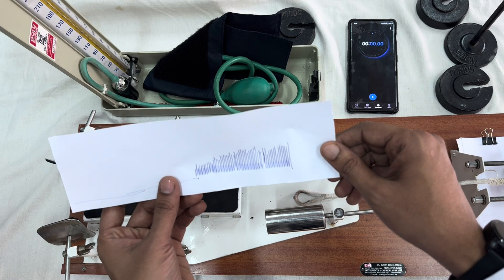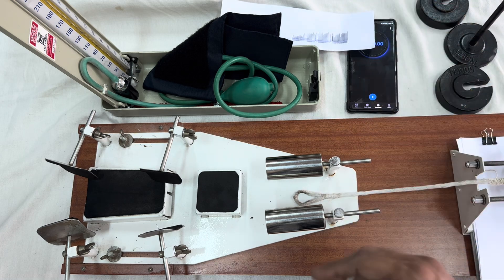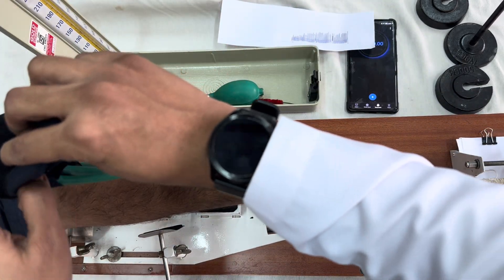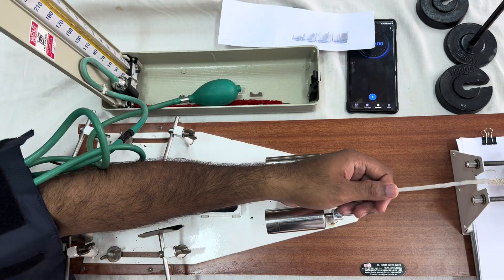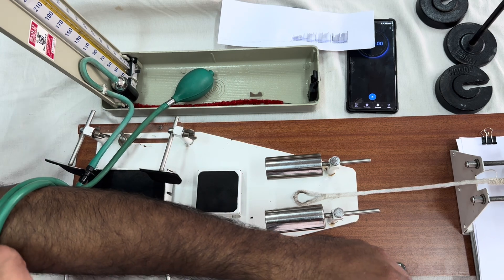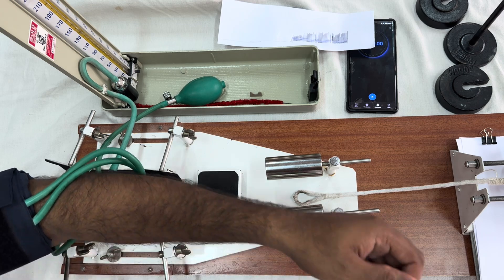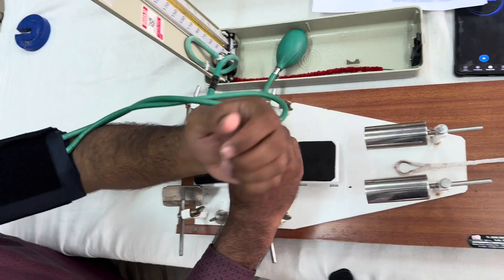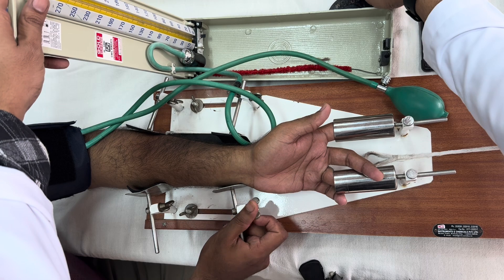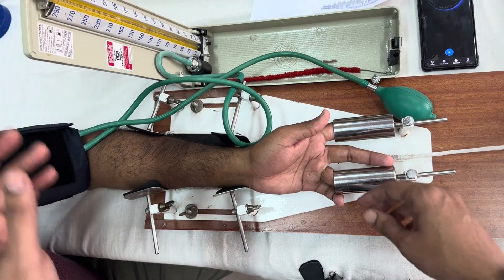We have already recorded the normal graph. Now we will observe the effect of venous occlusion. The same procedure is followed, except we need to occlude the veins. We use the sphygmomanometer cuff tied on the arm, the same way you measure blood pressure. Then raise the pressure in the mercury manometer up to 40 millimeters of mercury, so that the veins become occluded.